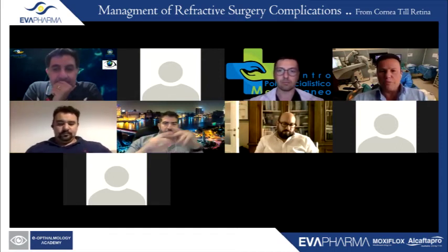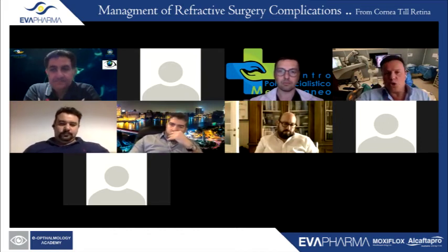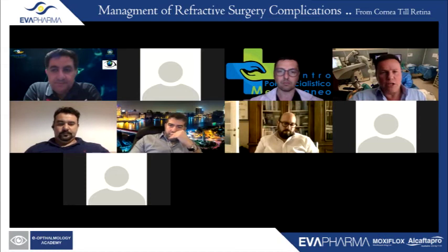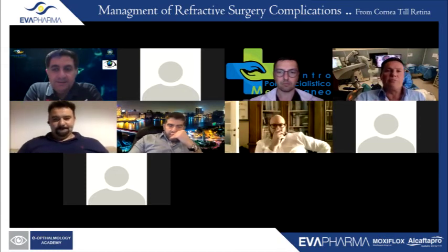When I have 2.8 millimeters or higher, and a nice open angle, I will put in an ICL, no problem. And they react very well. Of course, the pre-op refraction is a little bit more tricky.